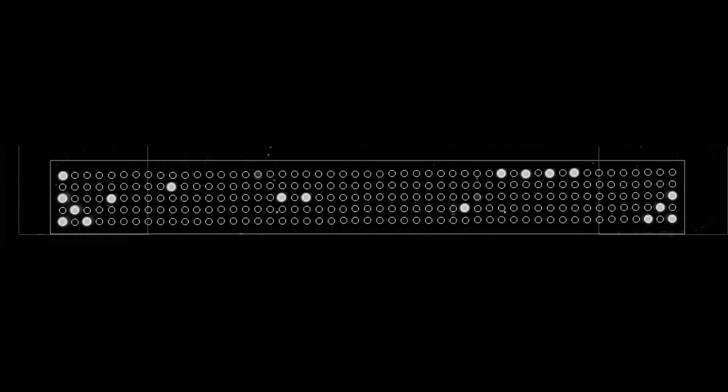The silver coating scatters light back to the camera, creating a visible spot on the slide if the target nucleic acid was present in the sample. The spots with no complementary sample nucleic acid attachments, and therefore no silver, do not scatter light back to the camera and remain dark. The instrument analyzes the slide to determine the presence or absence of light scatter.